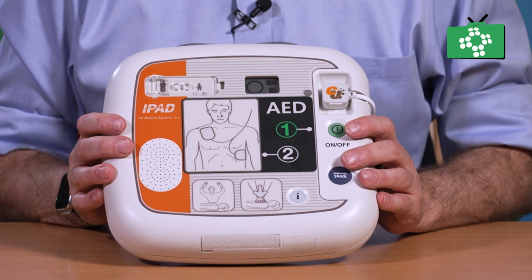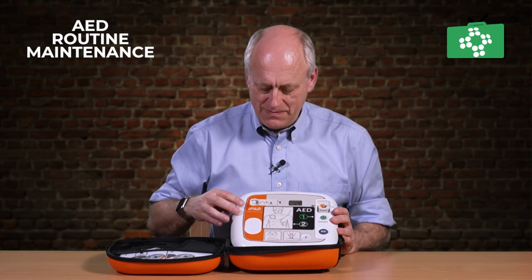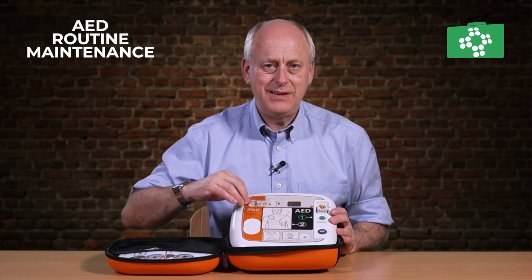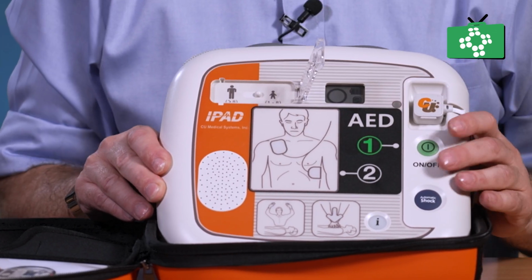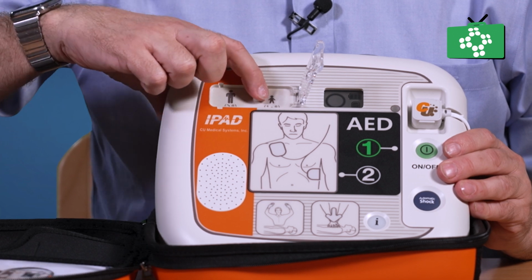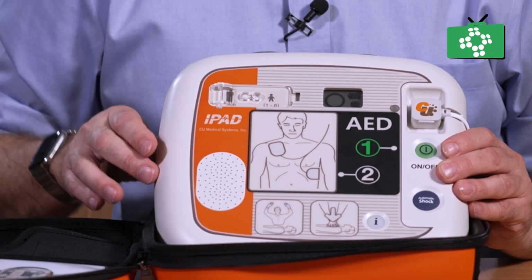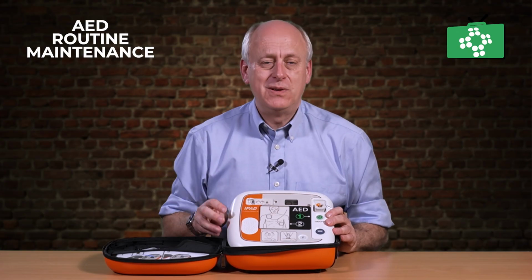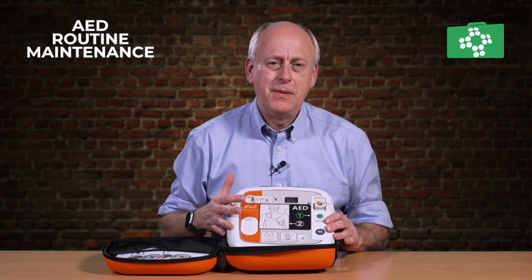So we've checked that the lights are working, we've checked that everything's okay, we've checked that the pads are all connected, and then just have a look to make sure there's nothing else. Generally speaking, we leave these in adult mode. If someone has done it and changed the switch up here into pediatric mode, it's probably a good idea to move that back over to the adult mode, just in case someone has changed that. But generally speaking, that should remain as it is. Otherwise, just have a good look at it and make sure there's nothing else that could be a problem. There's no water.